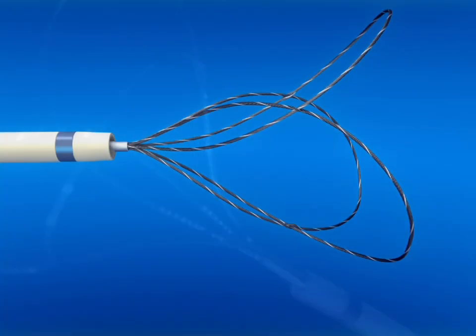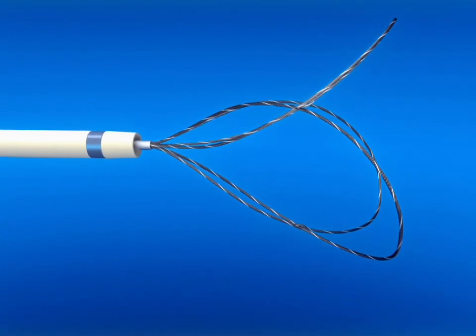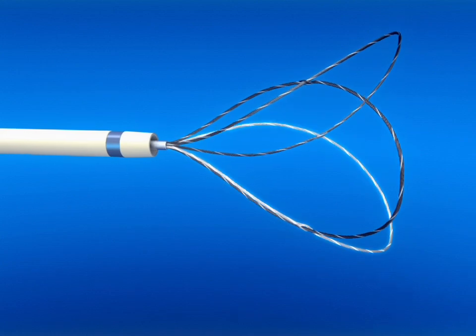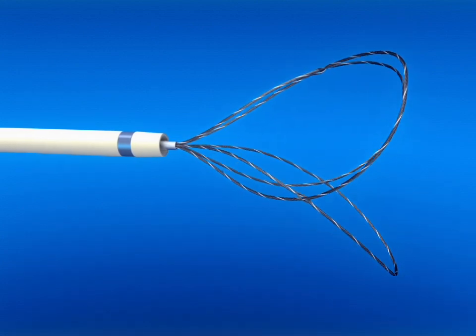The Merritt N-Snare system is uniquely designed with three loops to increase the probability of foreign body capture over single loop designs.